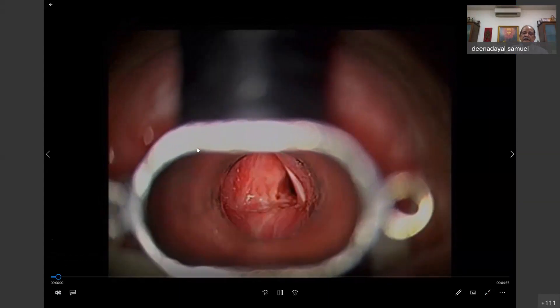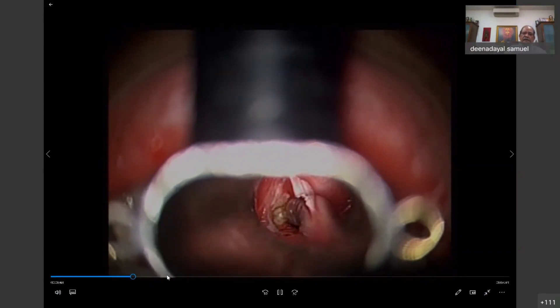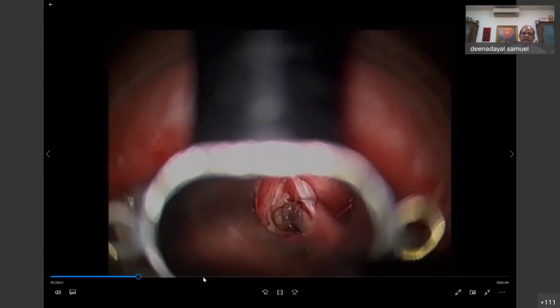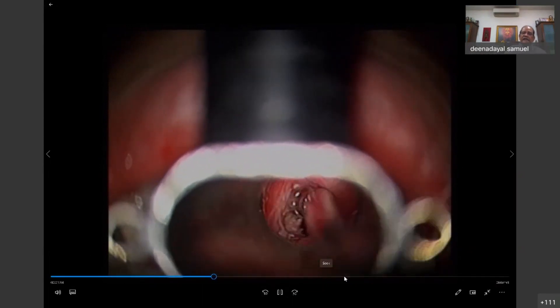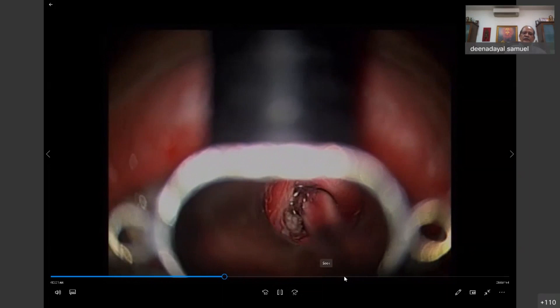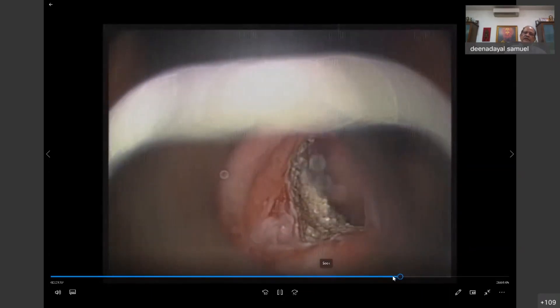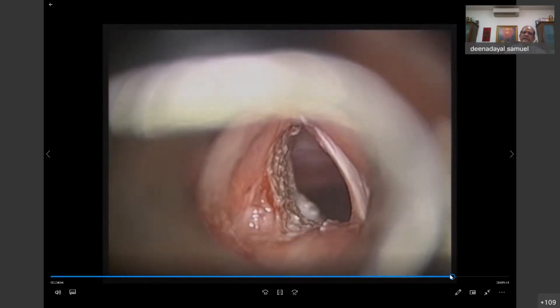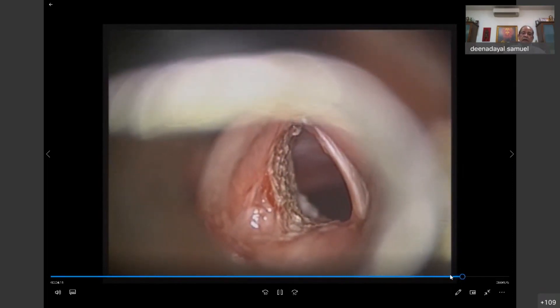This is a granular cell tumor on the left side where co-ablation was used. After taking a biopsy, it was excised. The granular cell is like an unripe fruit — not easy to ablate, it takes a little more energy. In the final picture, the granular cell has been completely ablated and the patient's voice was quite comfortable.